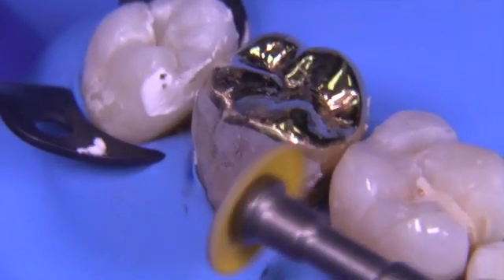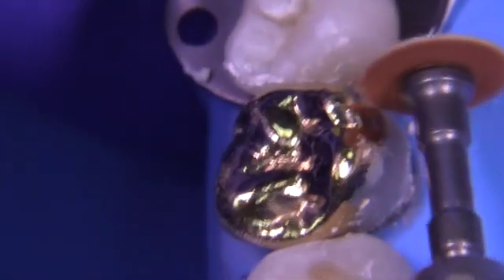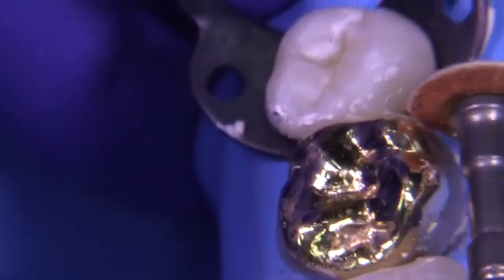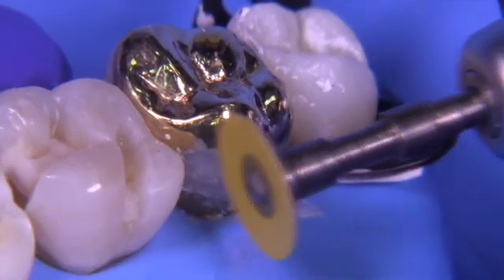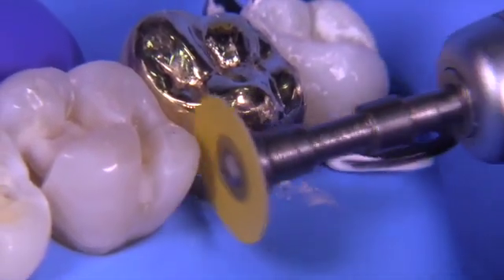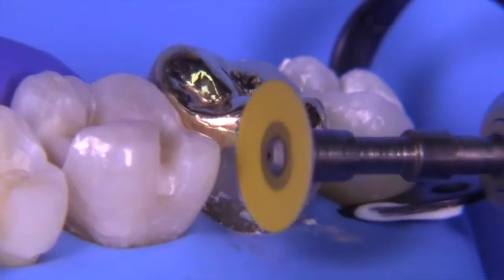Some parts of the tooth are easier to access than others, so you have to take your time. Now we're going counterclockwise with the disc, abrasive facing in, pulling from the distal-lingual towards the mesial. With the contra angle spinning from gold to tooth, abrasive facing towards me, the goal of this step is simple: get the gold and the tooth on the same plane.